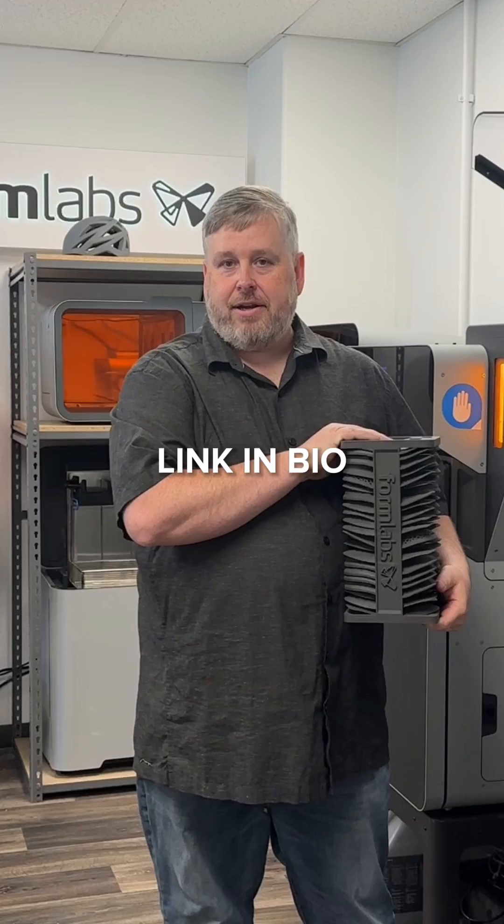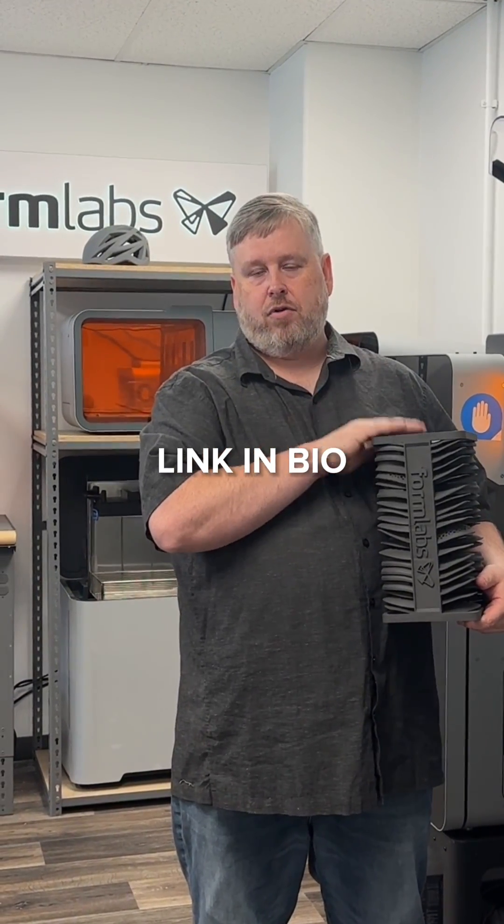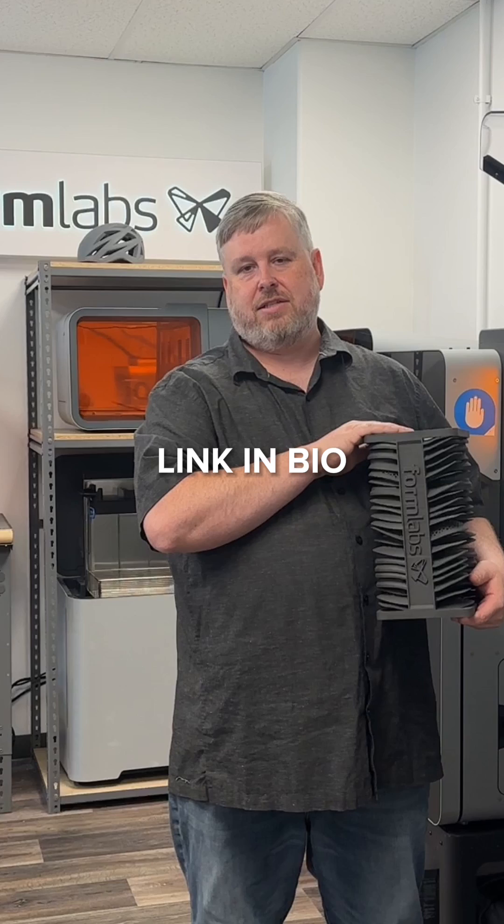So check out our website or contact one of our healthcare specialists to see why Formlabs Fuse OnePlus 30W is the solution for you.